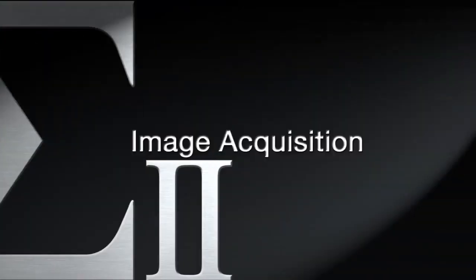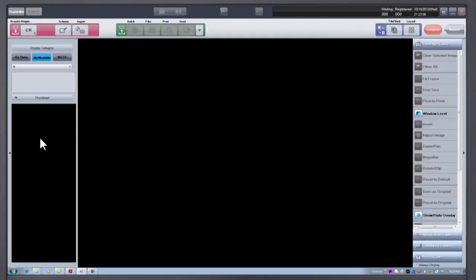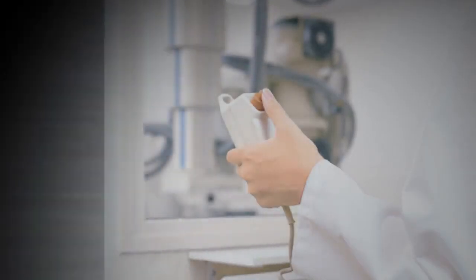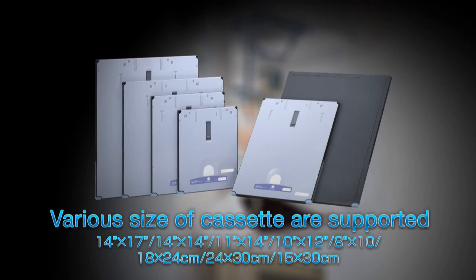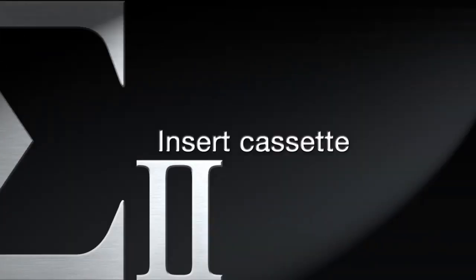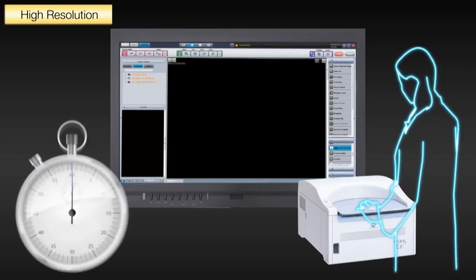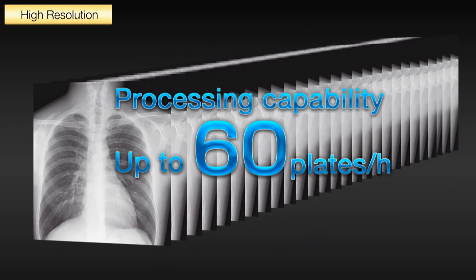To acquire an image, open the registered patient to the view screen, click on the CR button, and perform your X-ray exam with your normal exposure techniques. Insert the exposed cassette into the Regis Sigma reader. The powerful Regis Sigma operates at a throughput of up to 60 cassettes per hour at 14 by 17 inch sizes.